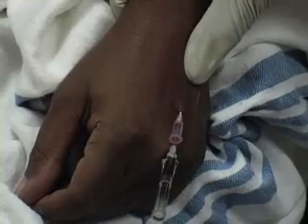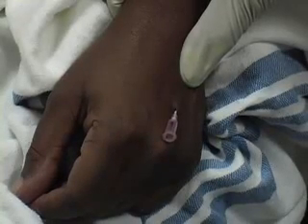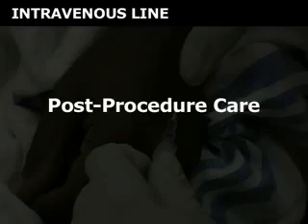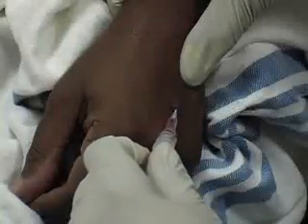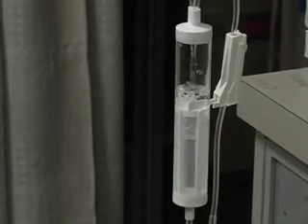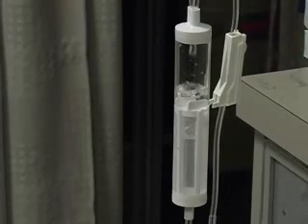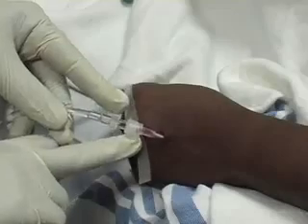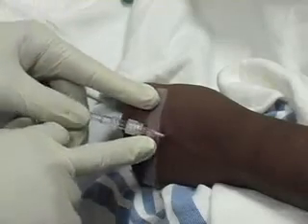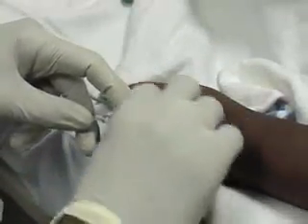After threading the catheter, occlude the proximal end of the catheter and remove the needle. Untie the tourniquet. Secure the IV tubing to the catheter by turning the port clockwise onto the catheter hub. Watch the IV drip chamber to determine if fluid is flowing freely through the catheter. This indicates that the catheter is correctly located in the vein and that it is functioning. Place a small piece of tape under the catheter hub and fold each side upward across the hub, then attach it to the patient's skin.